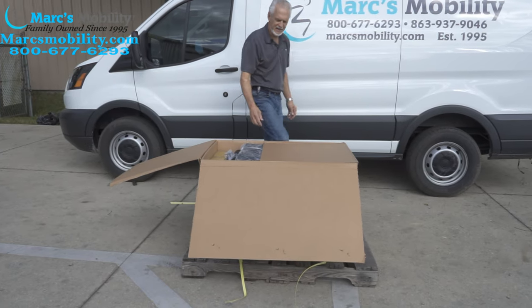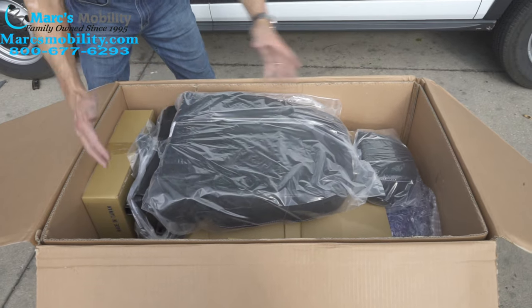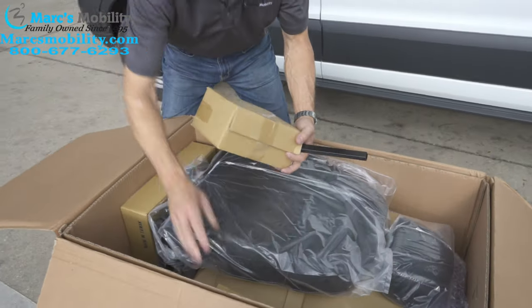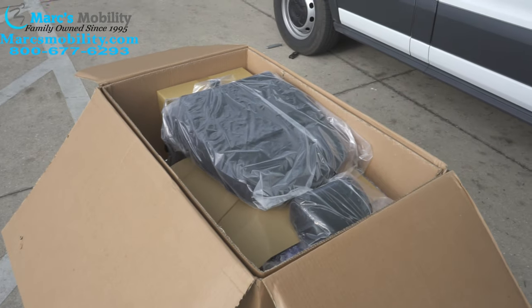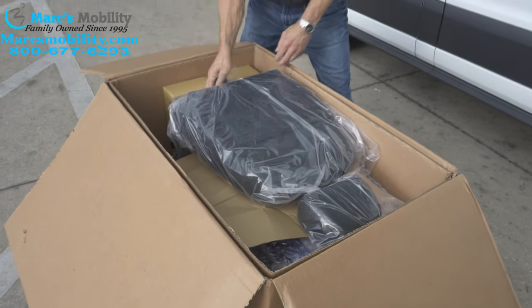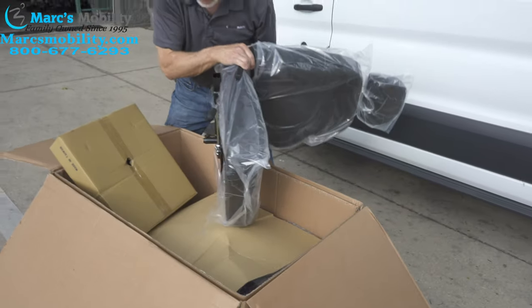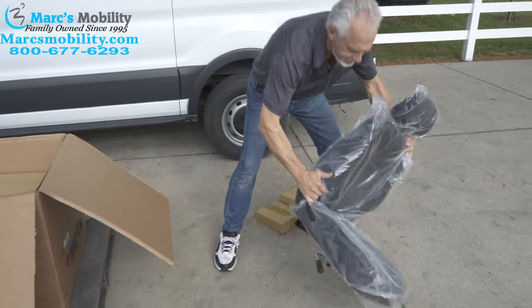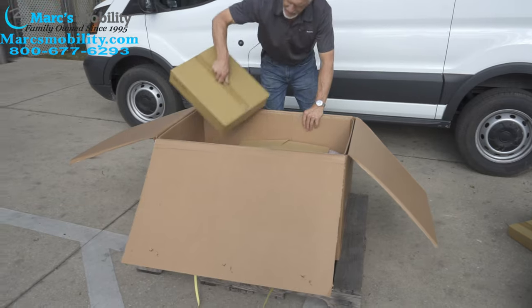Inside the box you will see — when you have the box open you can see your seat is upside down but there's a bunch of parts. What you will do is pull these boxes that have parts in them out of the box and put them here on the ground to the left. Then you will grab your seat right here. The seat is not light. There's your seat — put it down over here. There's also a box here with parts that was sitting at the end of the chair.